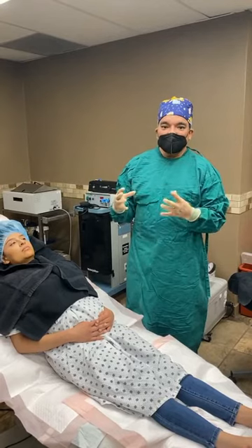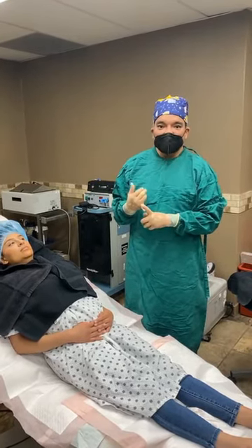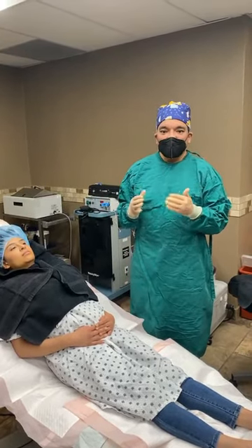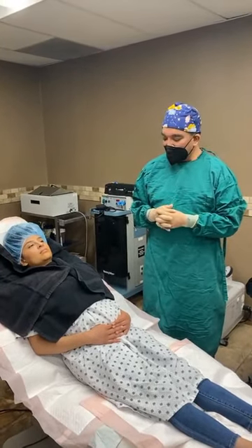But it's better to tumesce the tissue, hydro-separate the tissue with a tumescent solution. It works very well as an anesthetic, but also for hydro-separation to keep the cannula away from sensitive or important structures and vessels. So that's what we're going to do today.